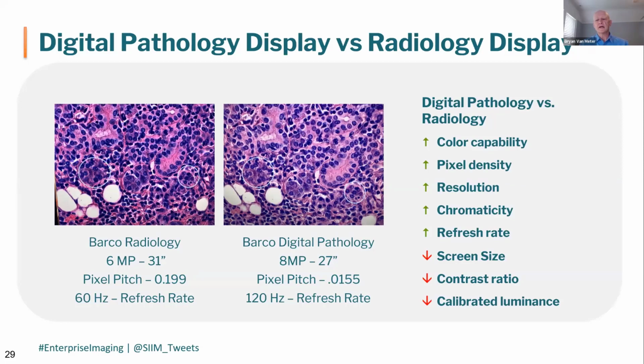And I hope this loads, it does. Okay, so in radiology, you're looking at black, which is air, and white, which is bone, and you want to have as much contrast as possible to see that individual grayscale. That is not the case in digital pathology. This is stained tissue. This is not a mathematical reproduction.